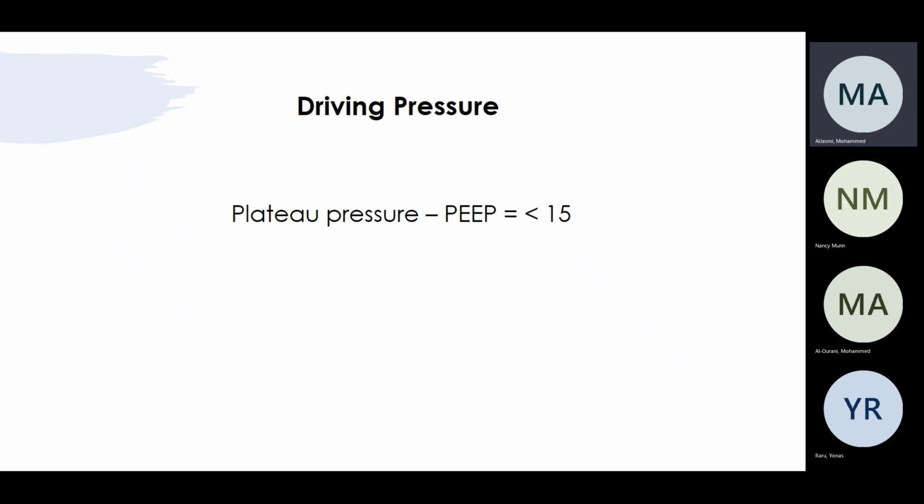Till now, all physicians have a different take on driving pressure, which is the plateau minus the PEEP. Some physicians work to make it less than 15. Some physicians just look at it as a parameter: if it's staying more than 15 for multiple days and I cannot change anything, that's a poor outcome. If you ask me personally about the use of driving pressure, I think about the patient as a whole. First of all, are you putting your patient on the appropriate mechanical ventilation settings or not?